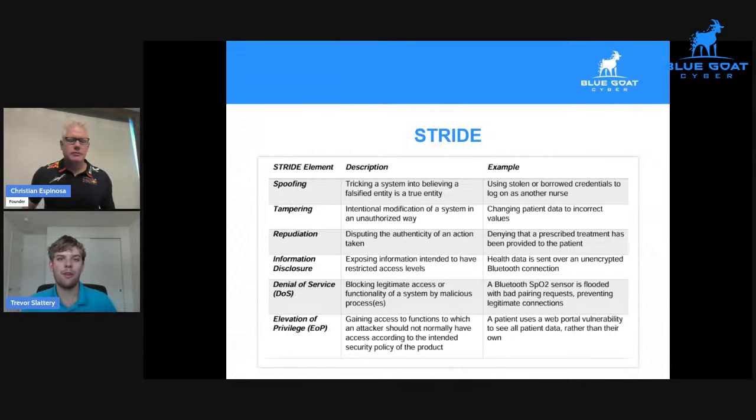And even that can be used for threat modeling mapping. It's not quite as comprehensive as a more fleshed-out framework such as STRIDE, but that is the traditional lens. That's cybersecurity 101. You look at confidentiality, integrity, availability. In this case, that's essentially going to be the integrity of results, the integrity of information. You want to make sure that's accurate. You don't want to cause a misdiagnosis.